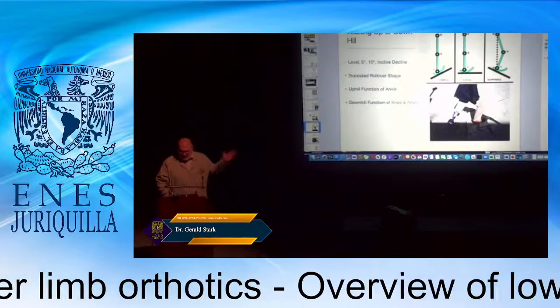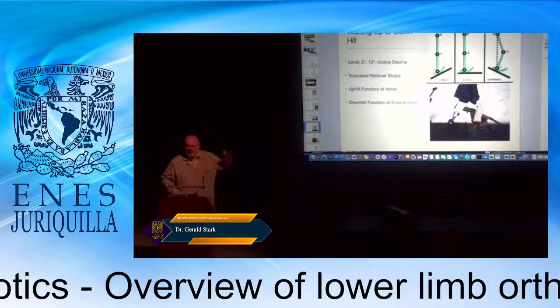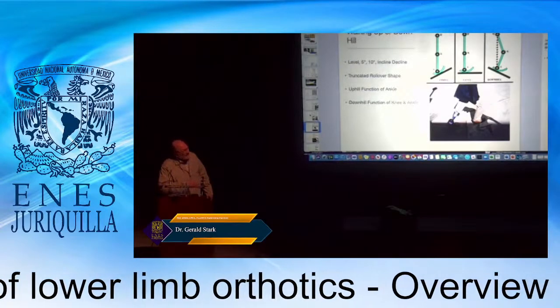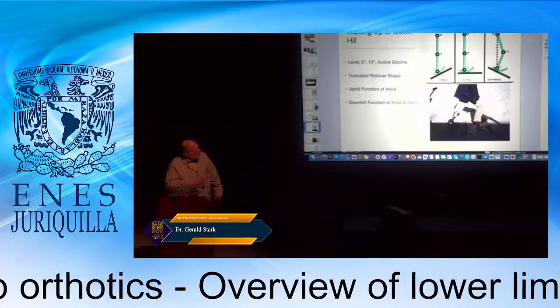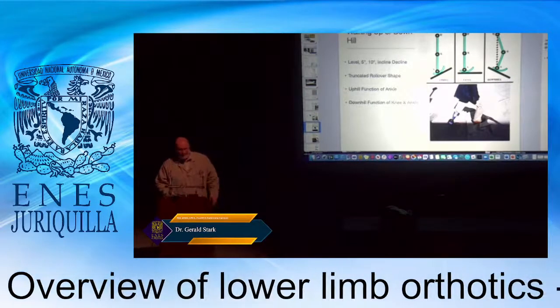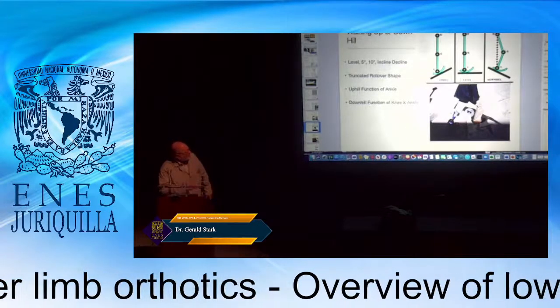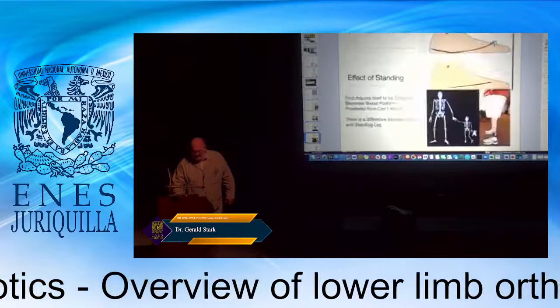The question we answered Tuesday was, does rollover shape change when you're walking up or down a hill? And the answer is it does not. The rollover shape is the same uphill, but your ankle is working to change that position on the surface level. But going down a hill, it's really kept at neutral, but your knee is working harder, which makes sense because when we dealt with patients who are transfemorals, you could see when they're walking up and down a hill, going up a hill is no problem, but walking down a hill is much more problematic.